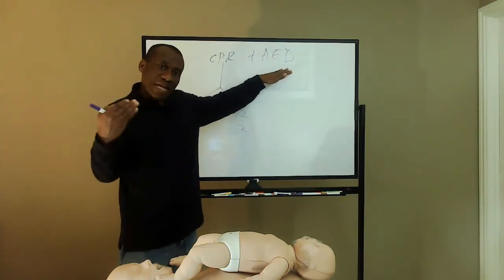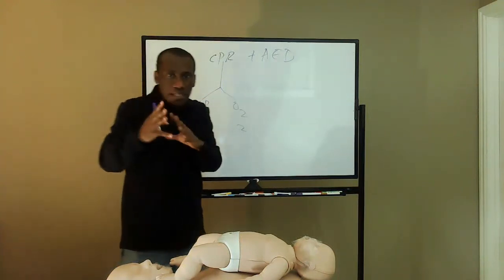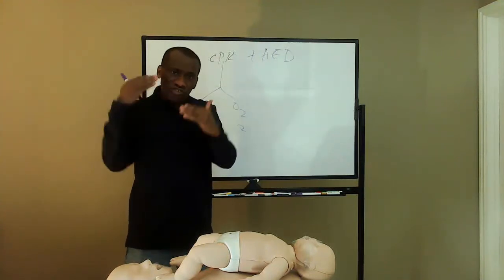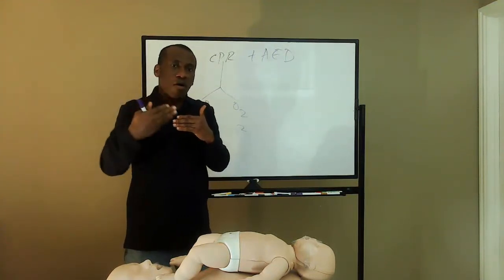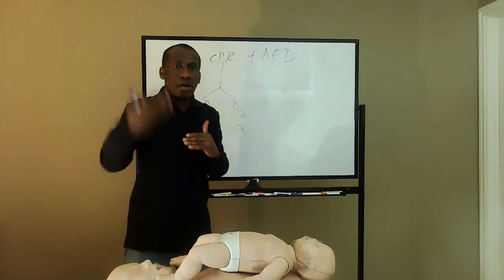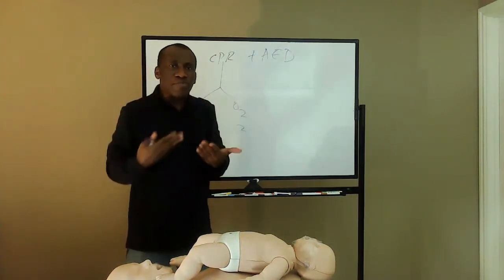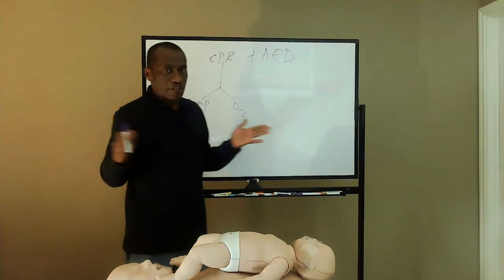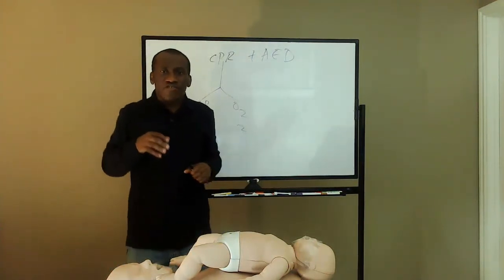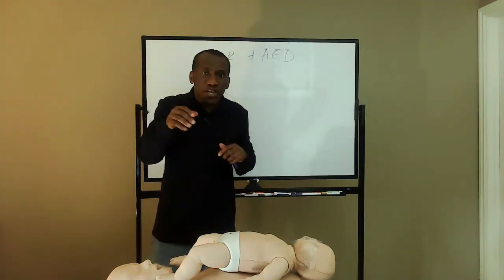If the shock button is pushed and the shock is delivered, that shock is capable of normalizing, resetting, rebooting the heart, because the heart is in what you call a fibrillative state, fibrillation. The heart in fibrillation is just quivering. If you check the heart, it may be shaking.